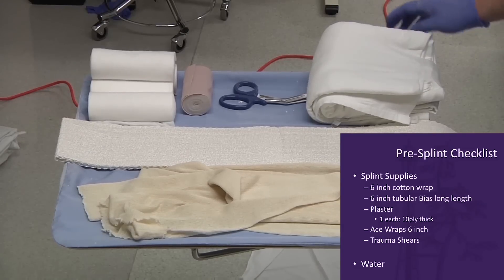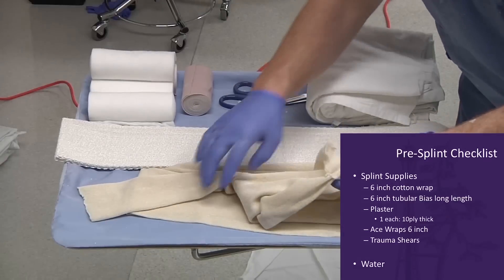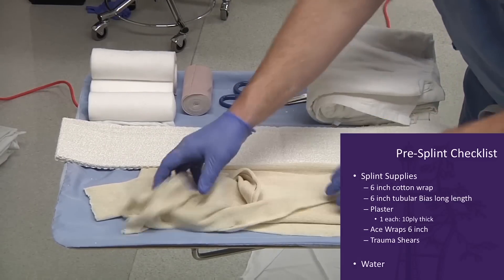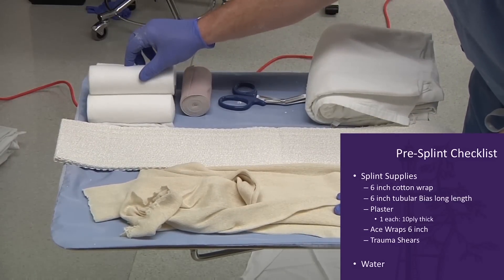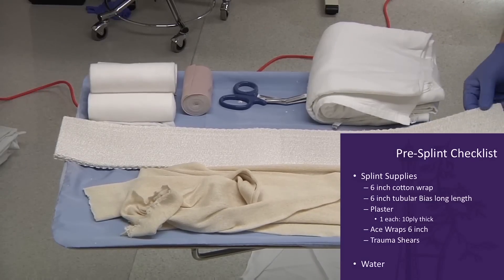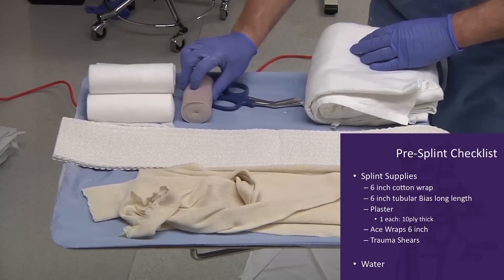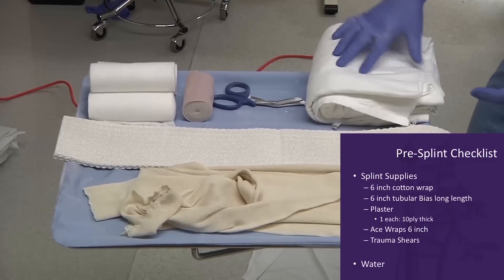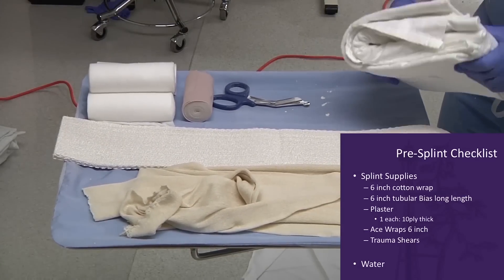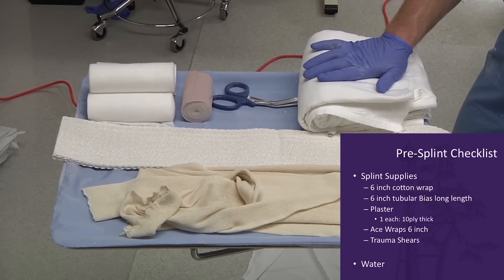These are our supplies for our coaptation splint that we place at Harborview Medical Center. We have a long strand of 6-inch tubular bias, 6-inch cotton web roll, generally a 10-ply thick 5-by-30-inch plaster slab, scissors, ace wrap, and also a pillow or a sheet that you roll up and tape to use as an abduction-type pillow if you're not putting the patient directly into a specialized abduction brace.